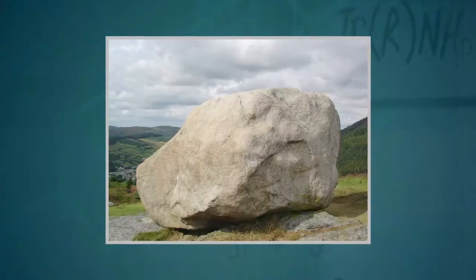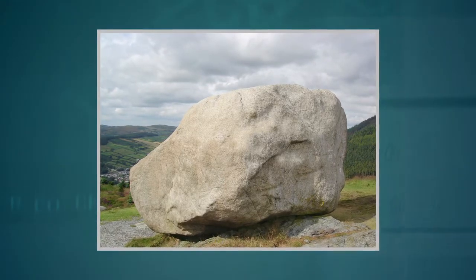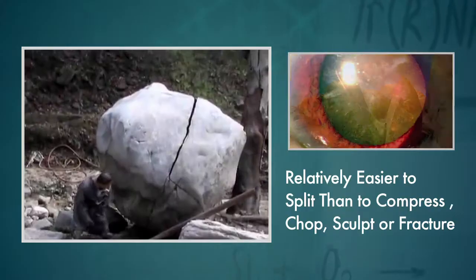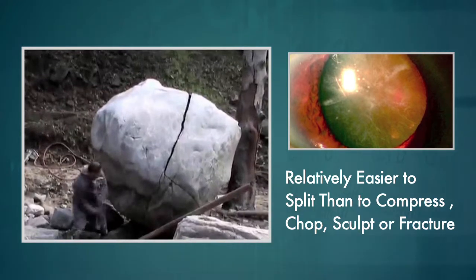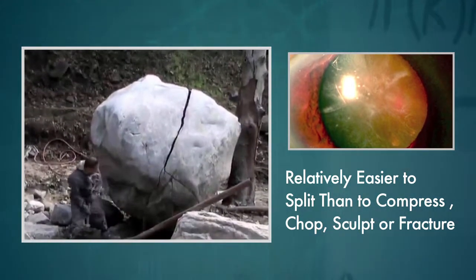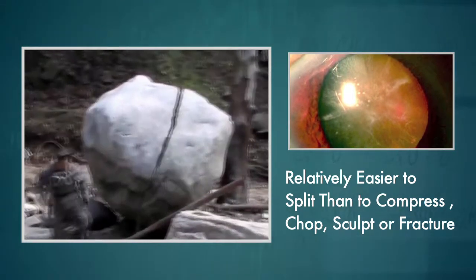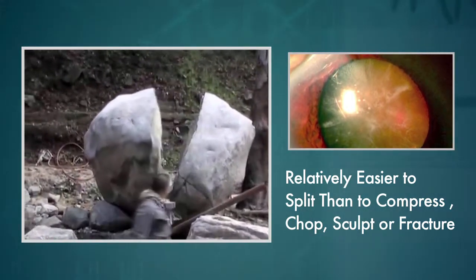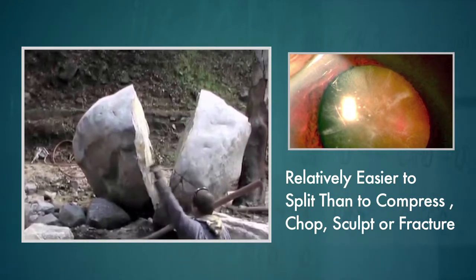Physically, hard mature cataracts are identical to solid hard rock, stronger in compression but weaker in tensile strength. It's relatively easier to split or pull apart these hard nuclei than to compress, chop, sculpt or fracture. To achieve full-thickness nuclear segmentation, it's always better to apply lateral separation or dispersive forces instead of compressive forces at the point of natural weakness along the cleavage plane between the lens fibers.